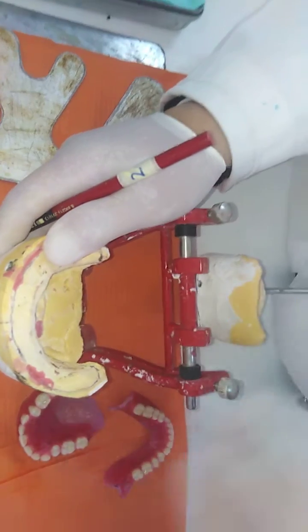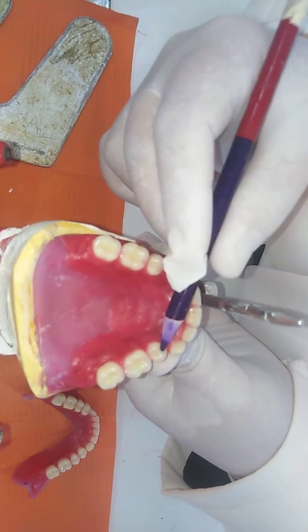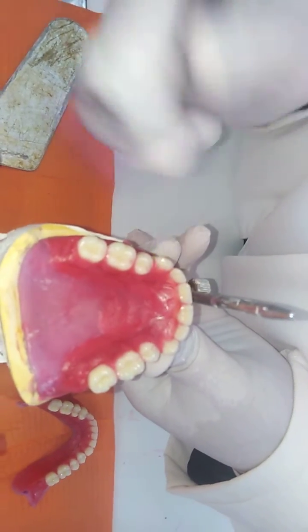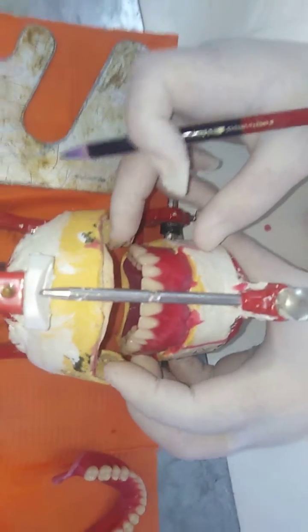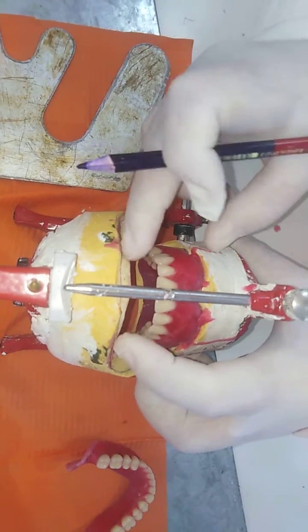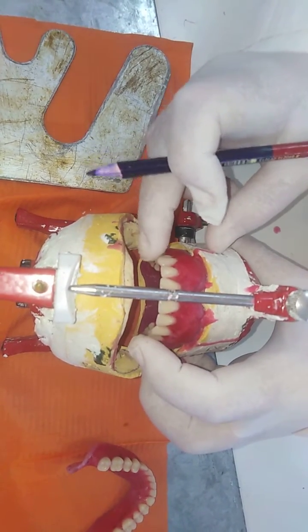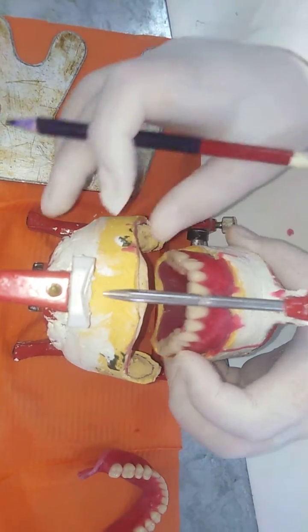So if we look at the upper setting, this is the upper base plate. We find that the number of teeth is reduced. They have taken out one premolar. Why? Because when the mandible is going to the front, more to the front, that means we have a shorter arch here, even if we set all teeth, because it's advanced. So they remove one of the premolars from the upper. This is one of the modifications in setting for class 3 patients.